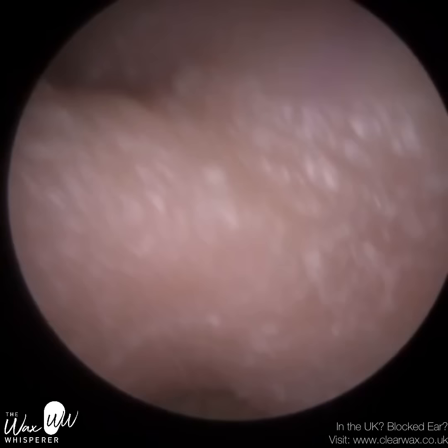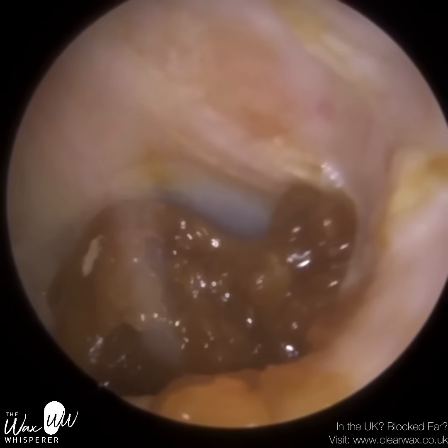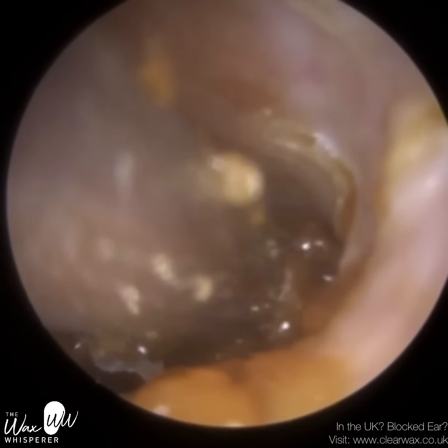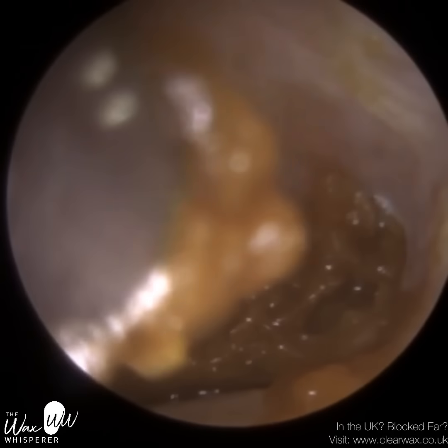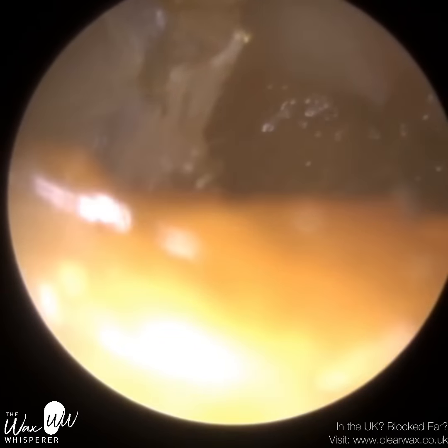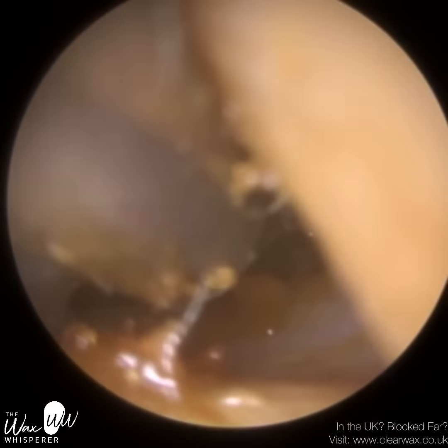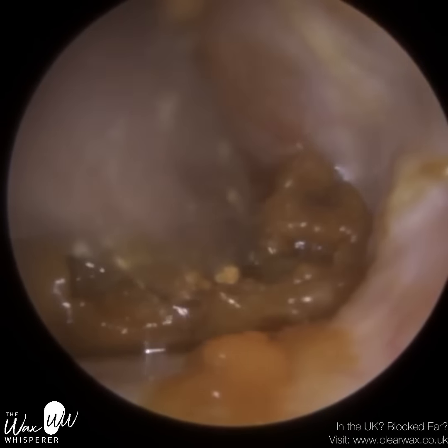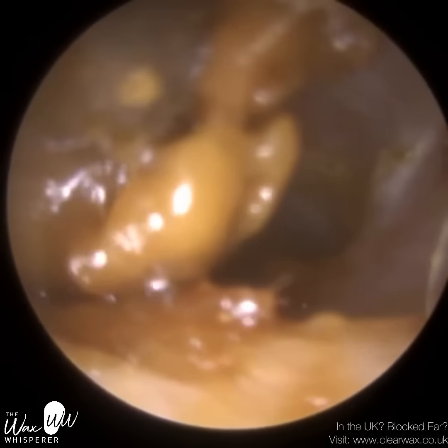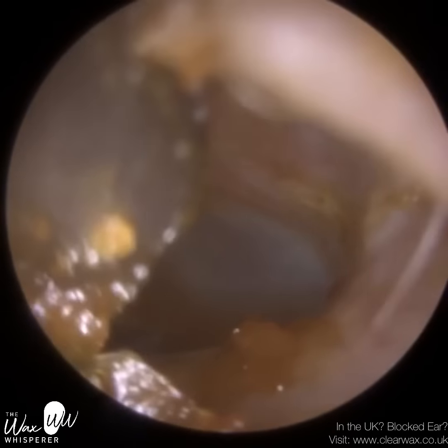Now, it's an elderly patient, so it's slightly unsteady, but the entrance of the ear canal was really collapsed. It was really narrow. I had to stretch wide open the entrance of the ear to even get access, and you can see there's a lot of dead, mushy wax and also dead skin. So 60% of earwax is actually made up of dead skin. In this patient, probably a bit more, and they didn't really notice that their left ear was causing them problems, because obviously the right ear was so bad. The brain was more focused on that, and it was a major relief when I removed all this from the left ear.